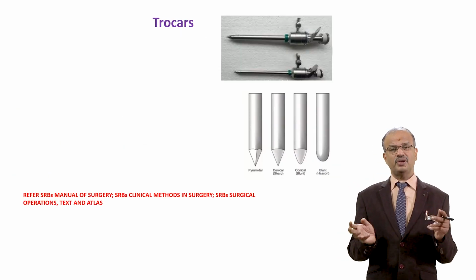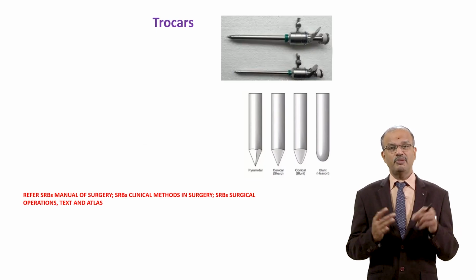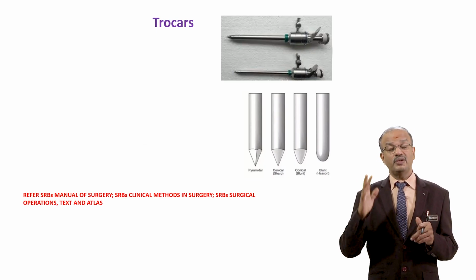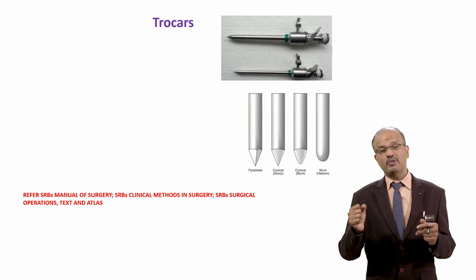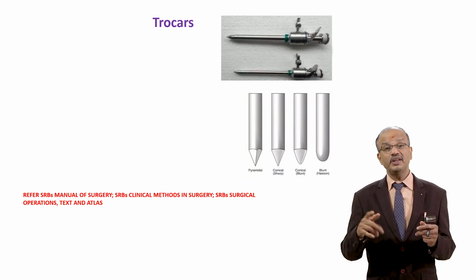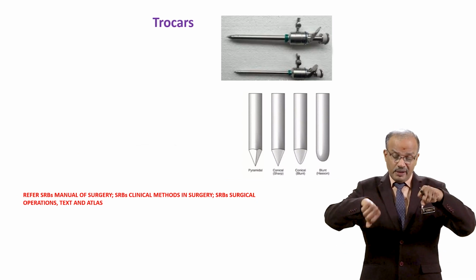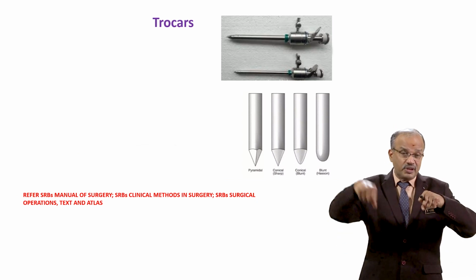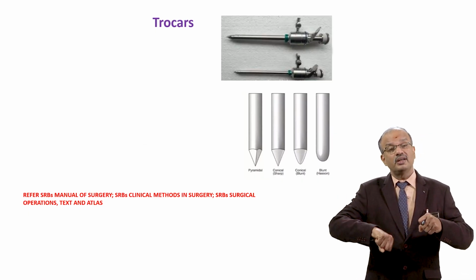So the next thing is the trocar. Once you put the Veress needle, then the trocar is important. Usually a 10 mm trocar you put again. When you are using a Veress needle, distension is there. First, the primary trocar for the camera, usually 10 mm. That's a blind procedure. So you should lift the abdominal wall properly, then guide it a little obliquely so that you don't directly puncture it. It may go into the bowel, sometimes into the vessels also.